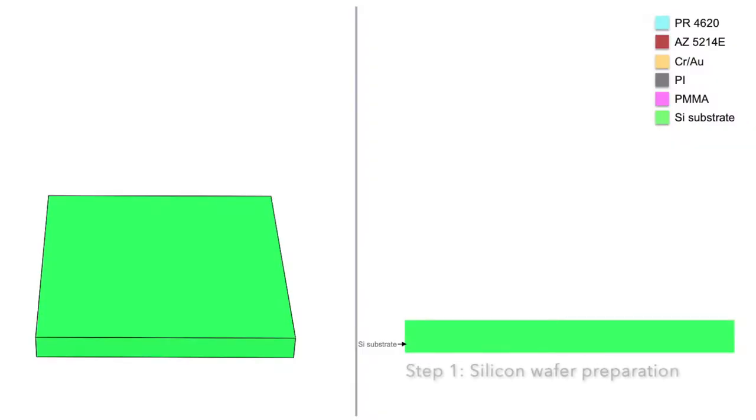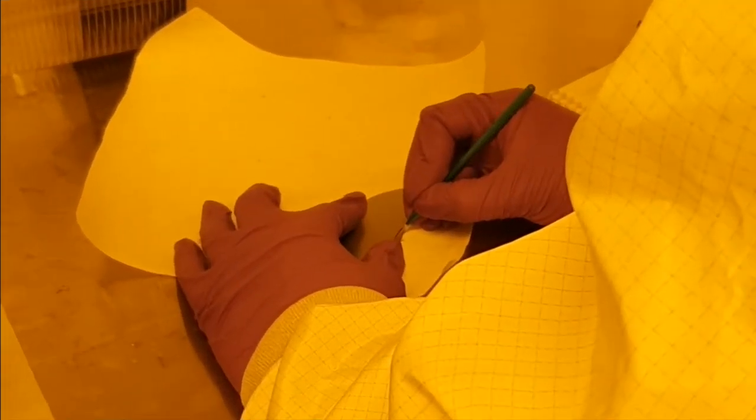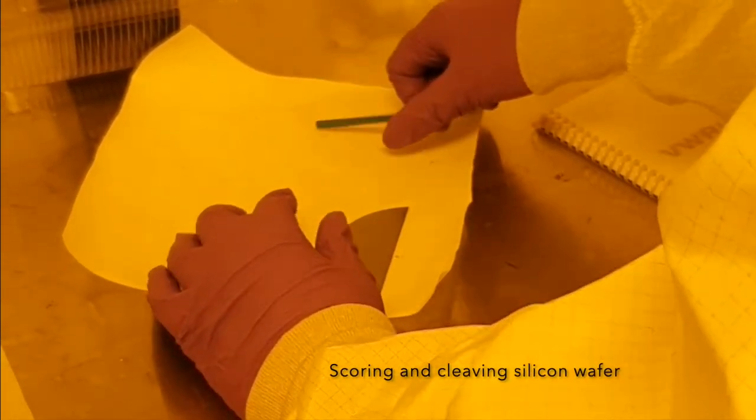First, we use a flat, polished silicon wafer as our base substrate. This makes a good choice for conformable devices because the substrate remains stable under different thermal and chemical conditions that will be used to process the sensor. Let's cleave the wafer to our desired form factor.